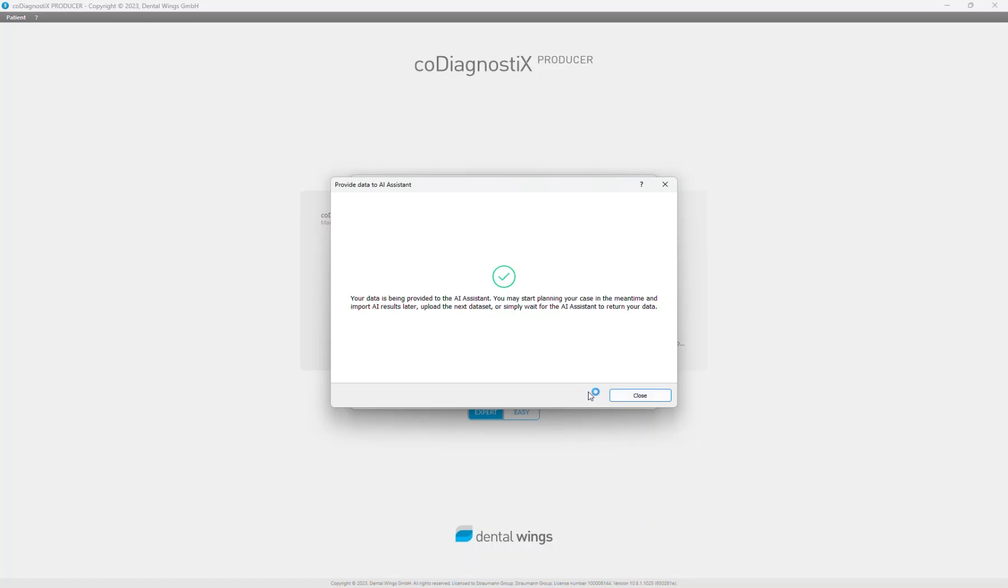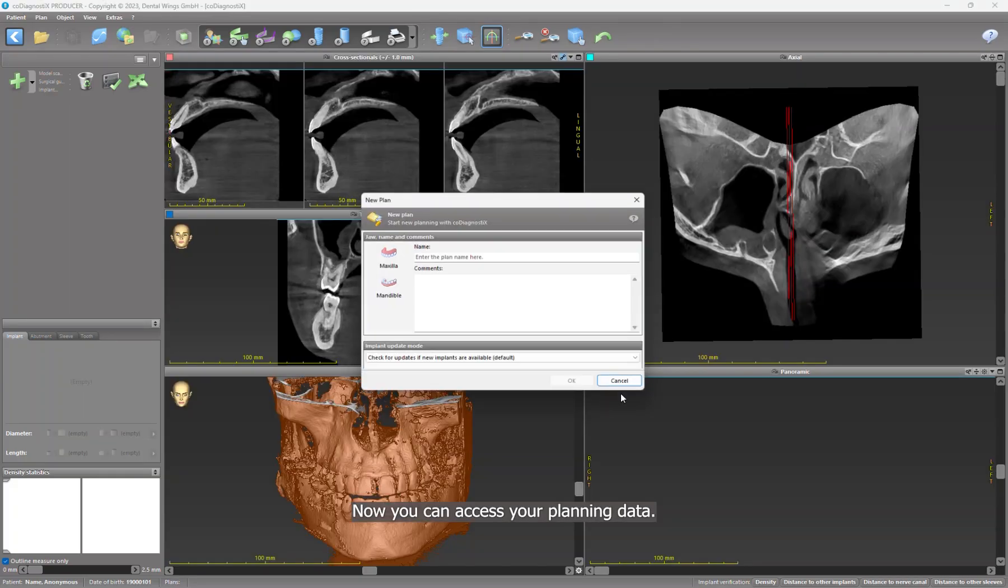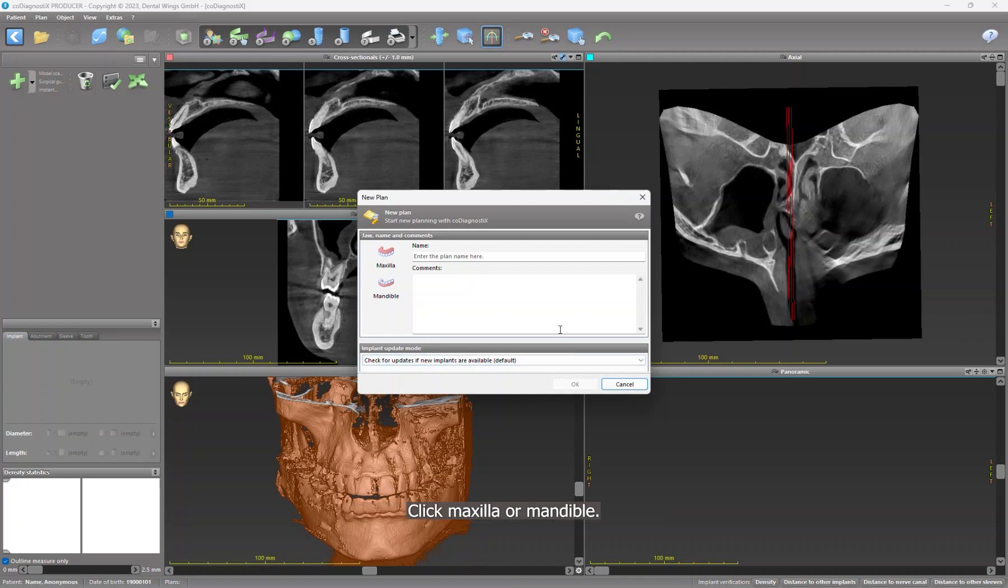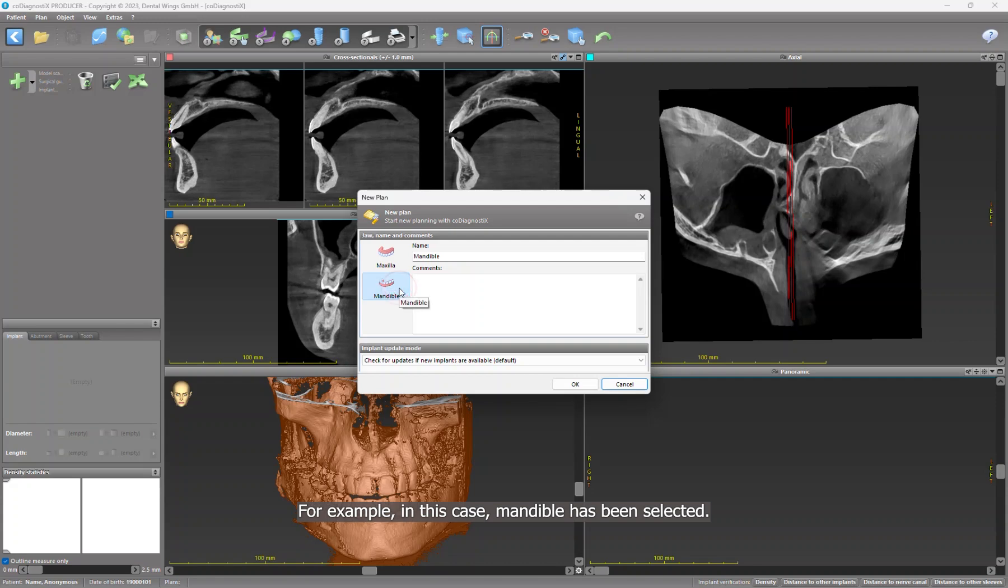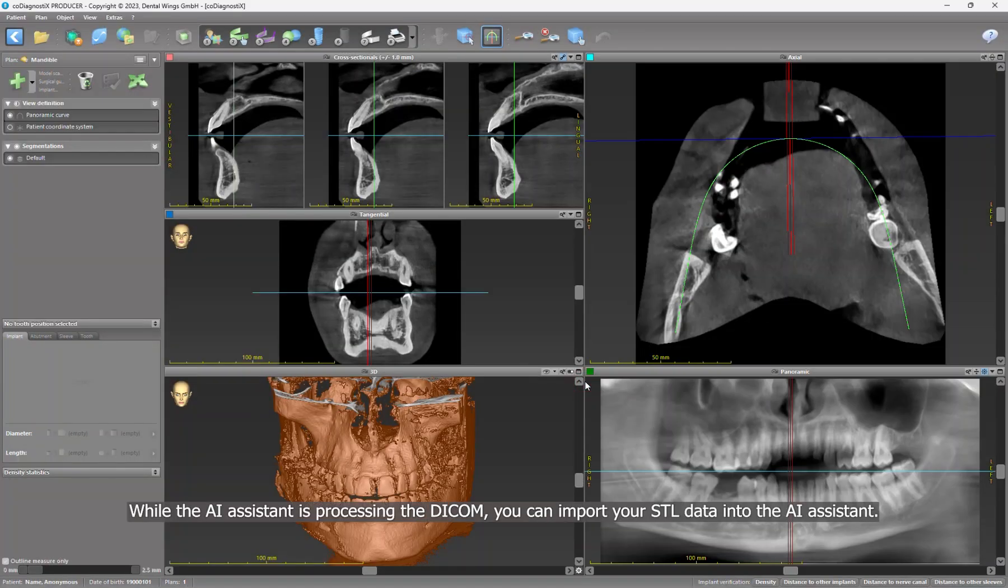Click on Close. Now you can access your planning data. Click Maxilla or Mandible. For example, in this case Mandible has been selected, then click OK. While the AI assistant is processing the DICOM, you can import your STL data.